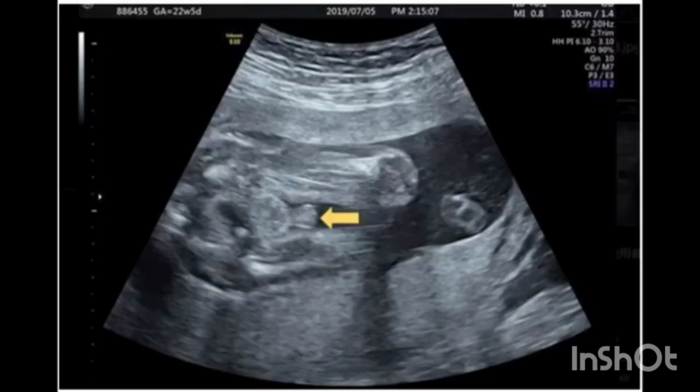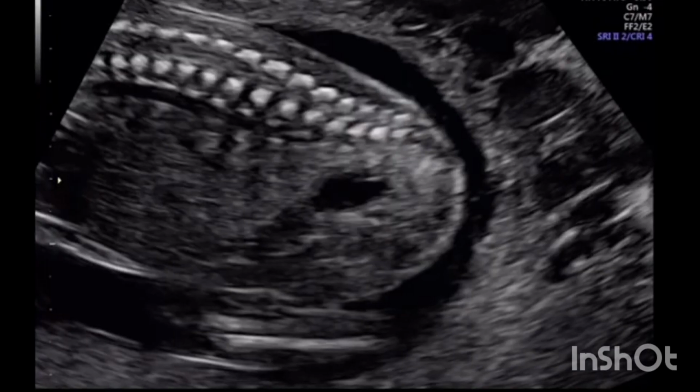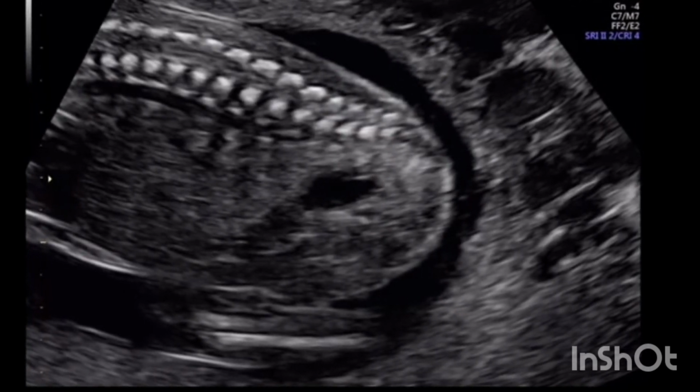You might be able to identify a penis on your own, but it's still a good idea to ask the technician if you're looking at the right thing. Keep in mind that sometimes another body part, like a finger, might be mistaken for a penis. The position of the fetus can sometimes make it difficult to tell for sure what is what.